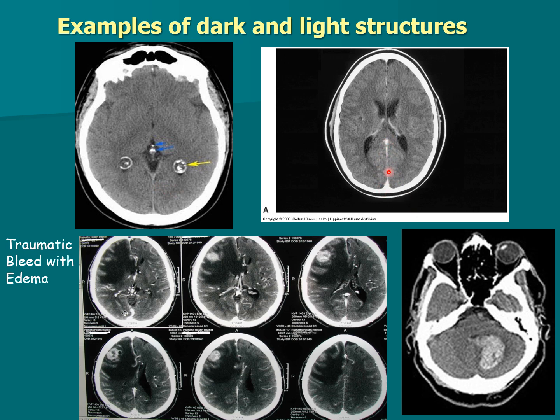This white line here, that's the falx cerebri. That is totally normal. It's dividing the brain into the right and left hemisphere, and it's dense enough that it shows up. And everything is good. This should be a straight line down here. We don't see a mass effect. A mass effect is when we have something shoving. It doesn't necessarily have to be a mass.